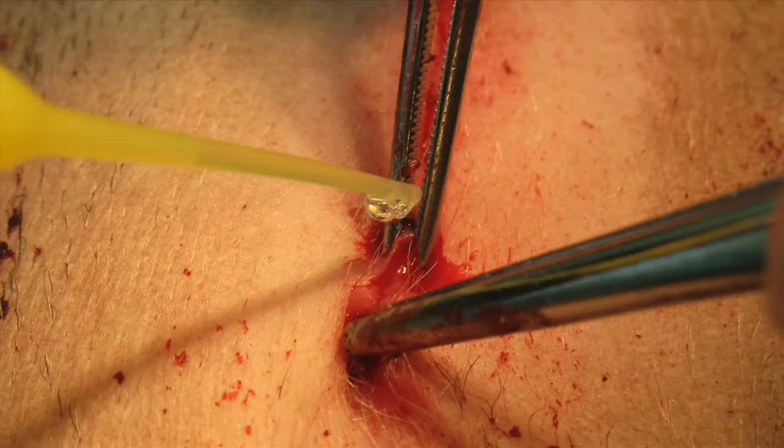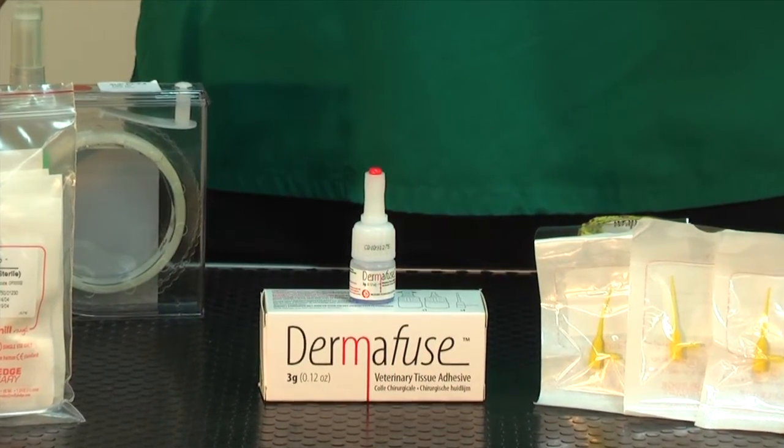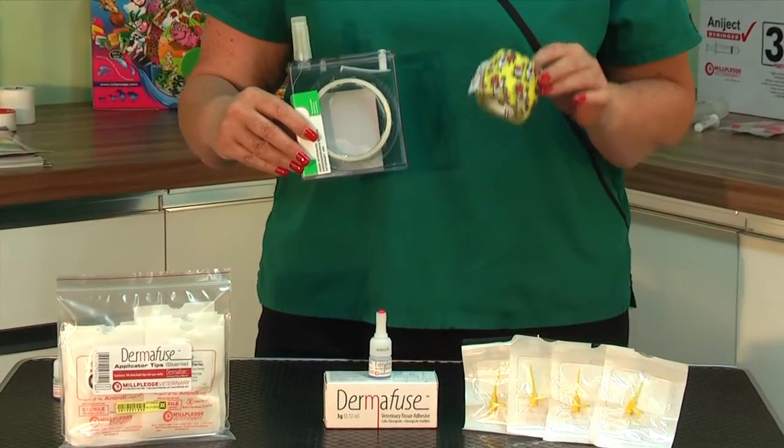Dermafuse changes from a liquid to a solid state by polymerizing within seconds to seal the wound. The Dermafuse will stop minor bleeding and binds the wound edges together, therefore this may eliminate the need for sutures or bandages.